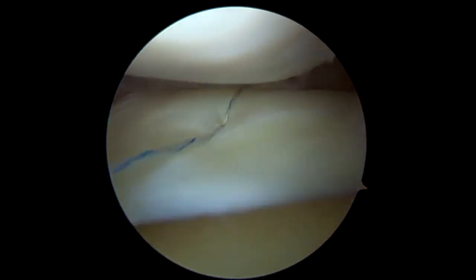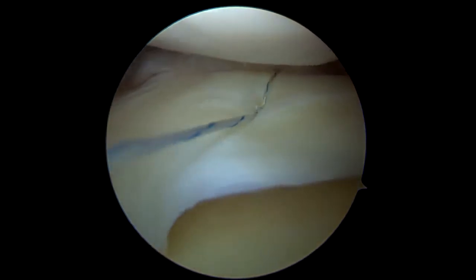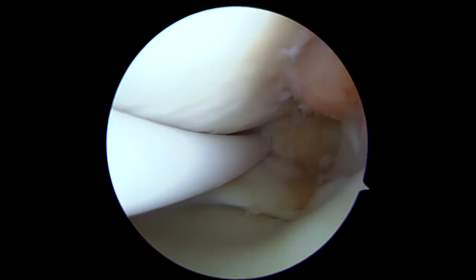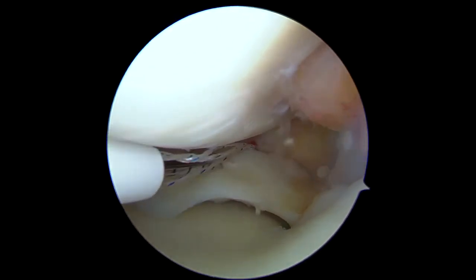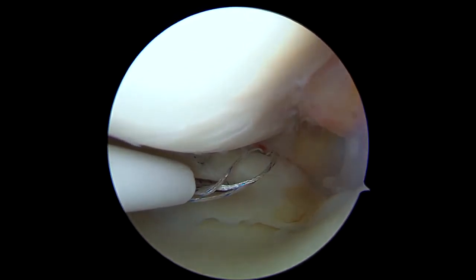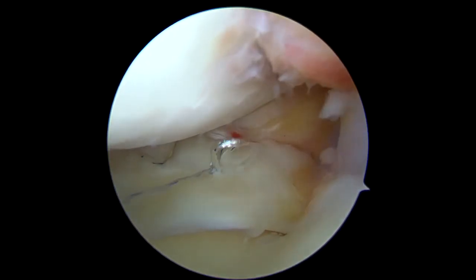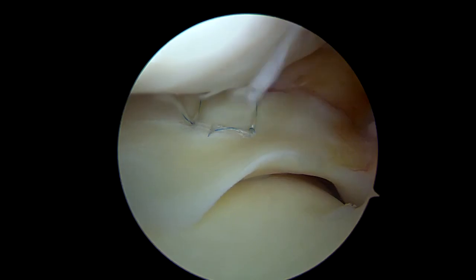The stability of the repaired lesion and the necessity of additional suture is evaluated. Additional suture is done for more desirable fixation with about 7 mm interval from the previous suture. The repaired lesion is examined again and confirmed to be stable with proper tension.